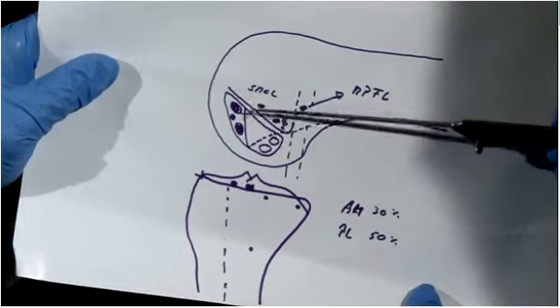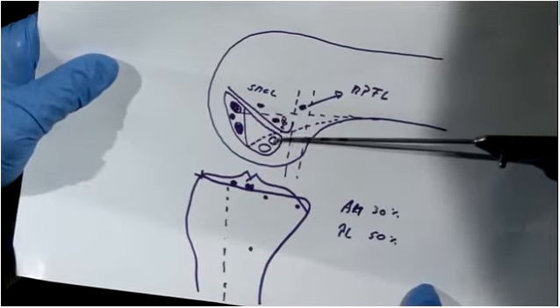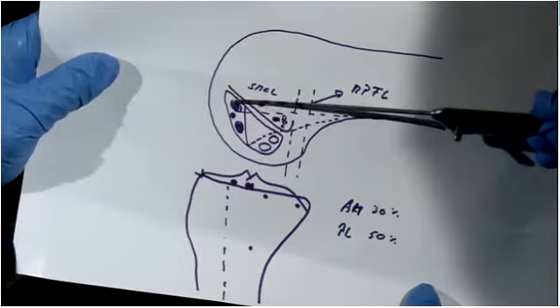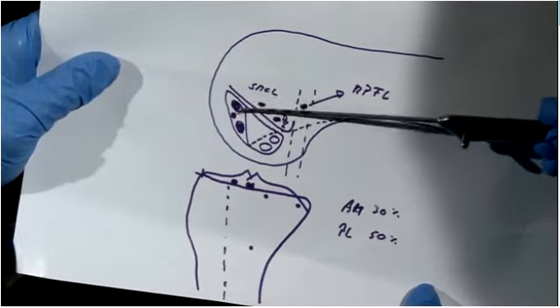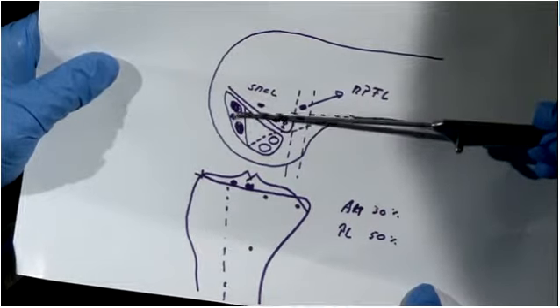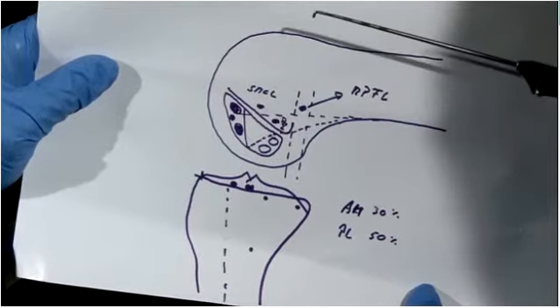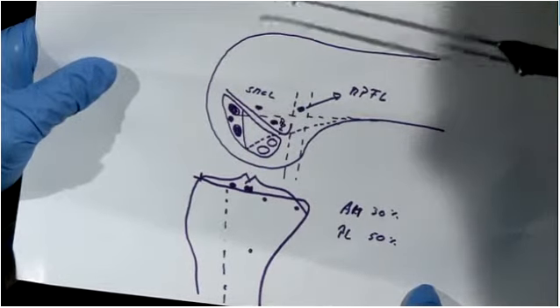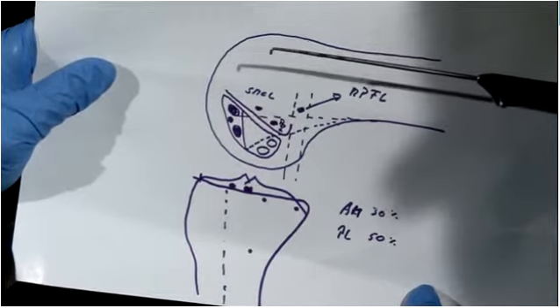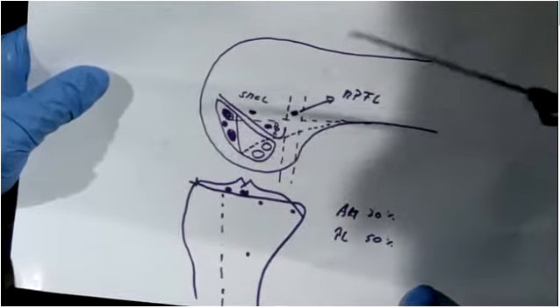Now, if we go to the medial intercondylar wall, for the PCL attachments on the femur, you have here the anterolateral one just on the top, and the posteromedial one just below. And in between, you have the anterior meniscofemoral ligament, the Humphrey. So these are the points we want to show you. Then we go to the lateral side as well. The lateral side, which I personally don't use for fluoroscopy guidance during surgery, but it's nice to see where we are. And now I give the word again to Charlie.